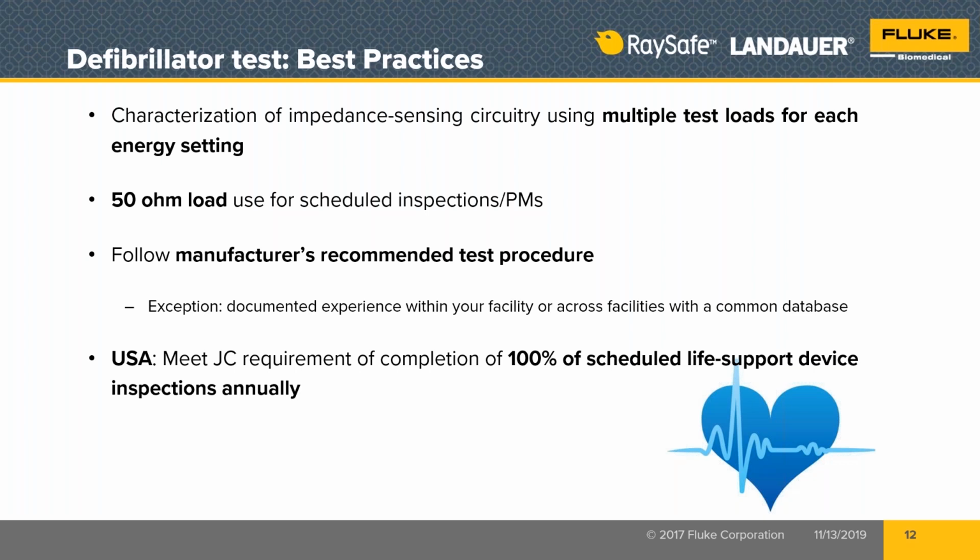I want to do testing at 50 ohms, but I also want to bracket or test below and above where we think this patient's impedance really was. And then I also want to know how much output energy was dialed in. If it's an AED, it's going to be whatever the AED is set to deliver. And sometimes there are 3 different energy levels and it escalates through.